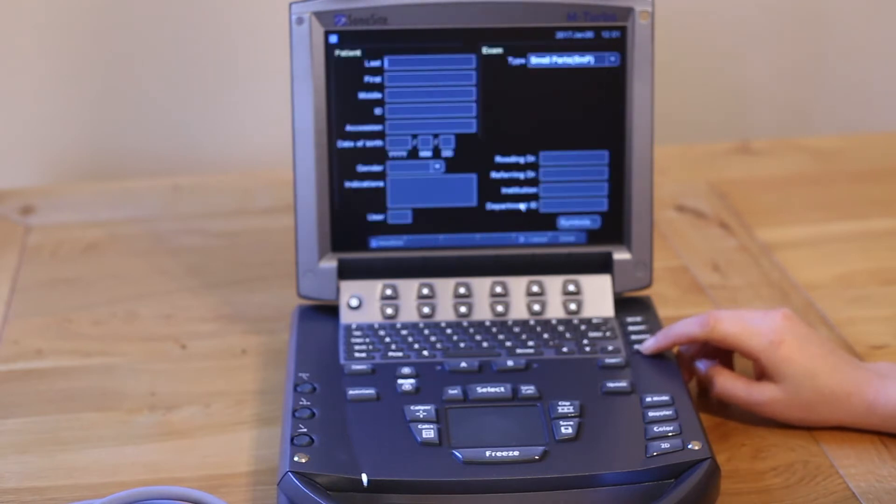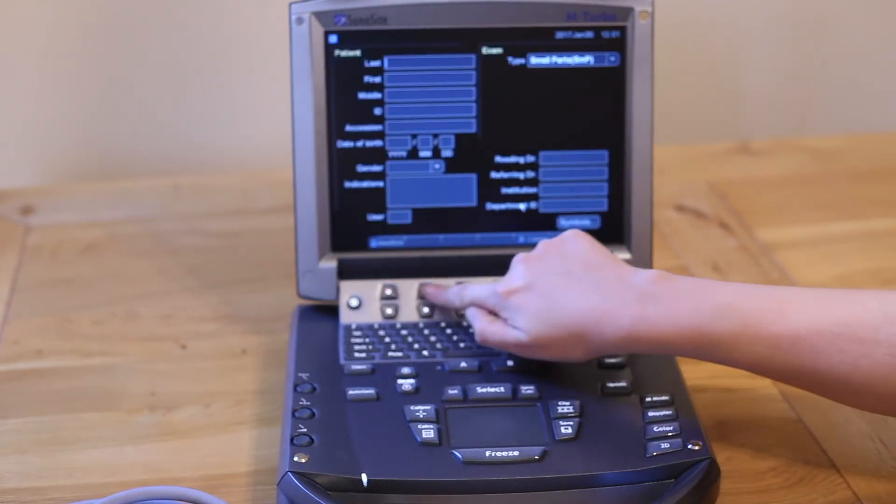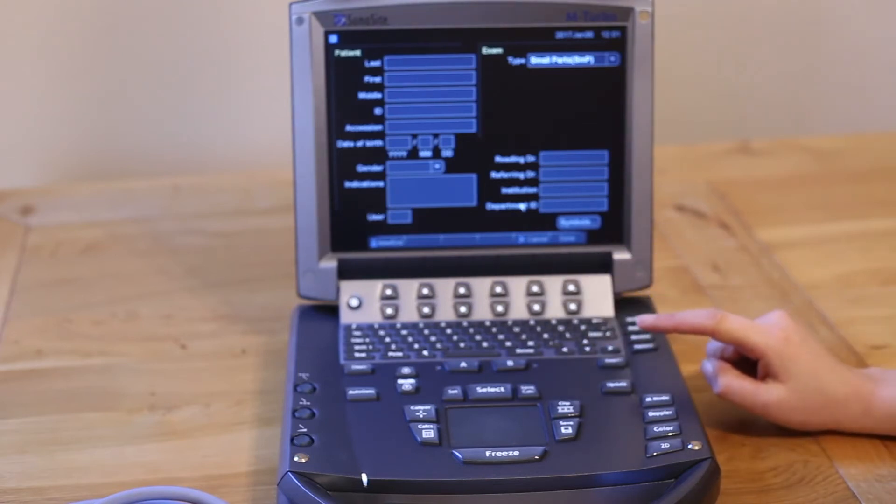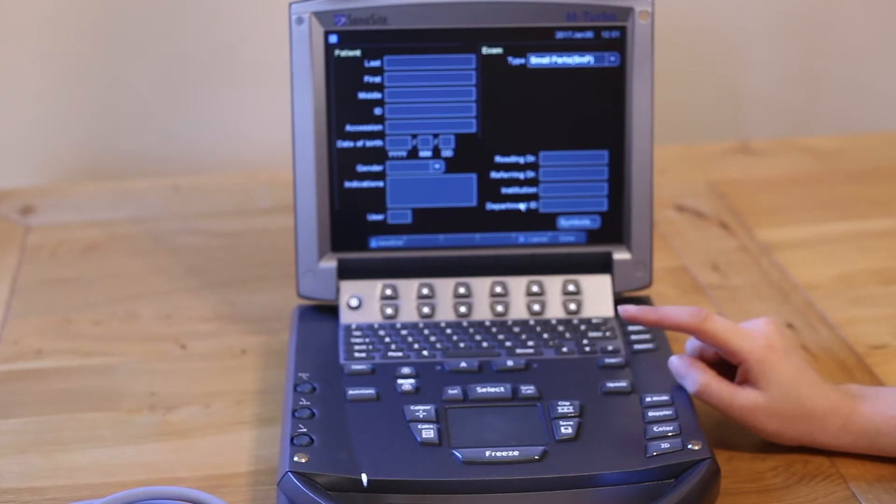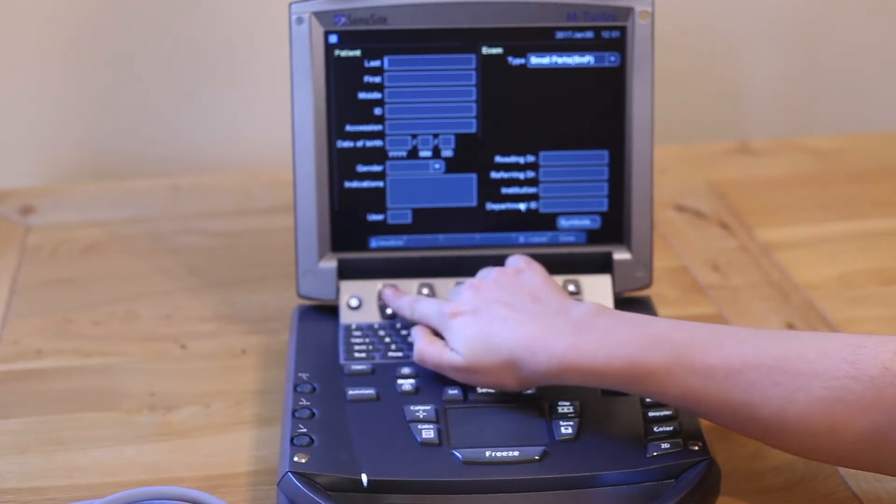The keys along the very top of the keyboard are known as soft keys. Their function changes depending on what screen you're in. In the patient screen, the first soft key on the left lets you add or end a patient.